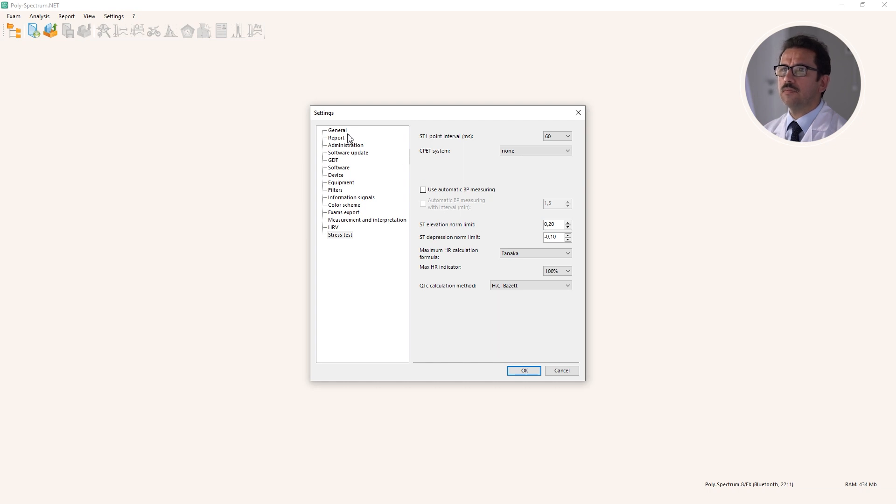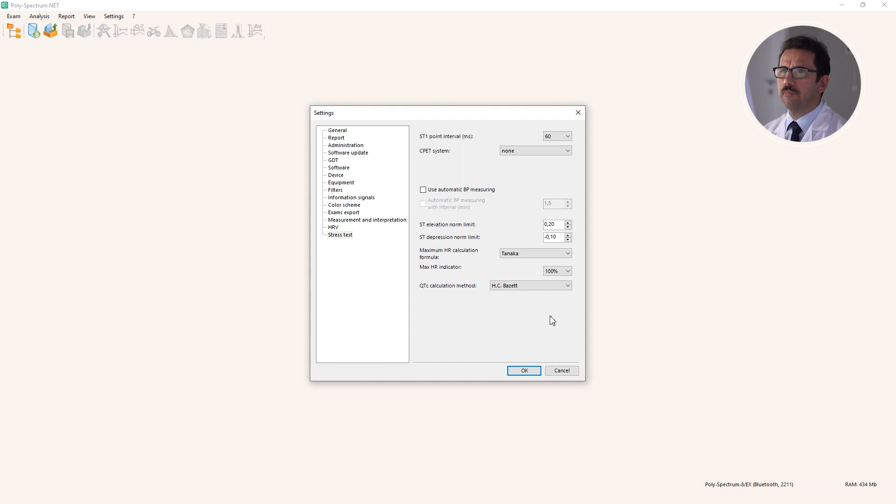What else? I think that's enough for settings that are required for basic operation of this software.